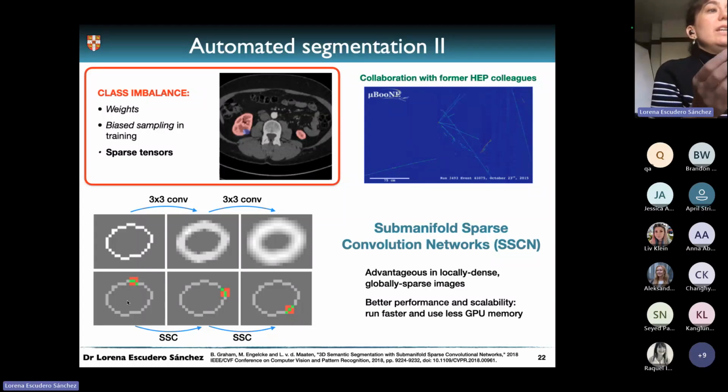Instead, what we want in this sort of scenario is to apply the same sort of convolution, but only keep as active the pixels and positions that were active in the input. So basically do the same operation, but avoiding this blurring, because it gets more and more blurry every convolution.